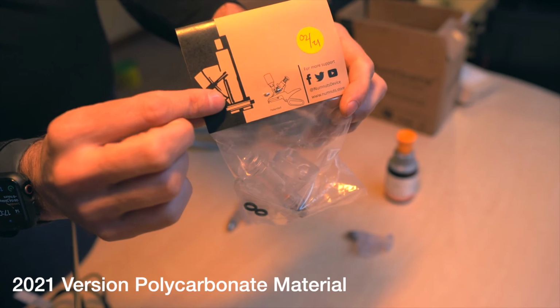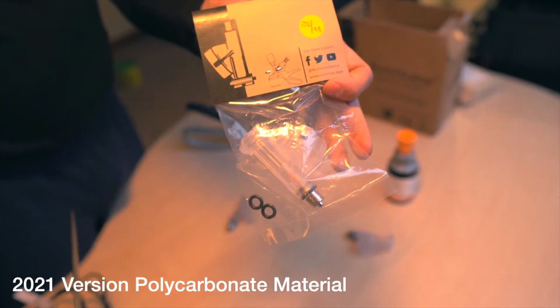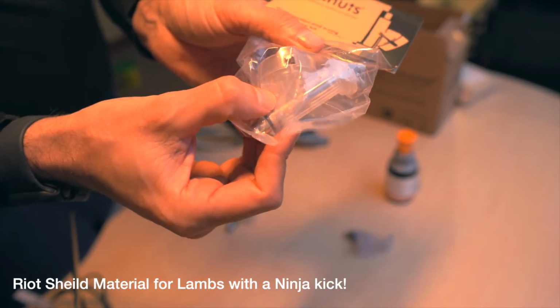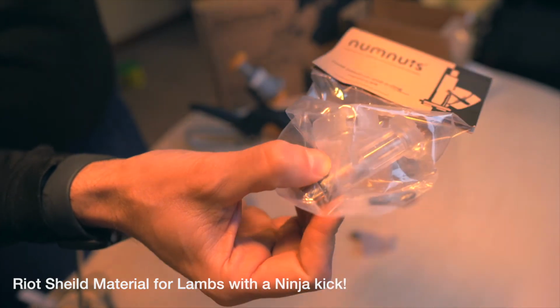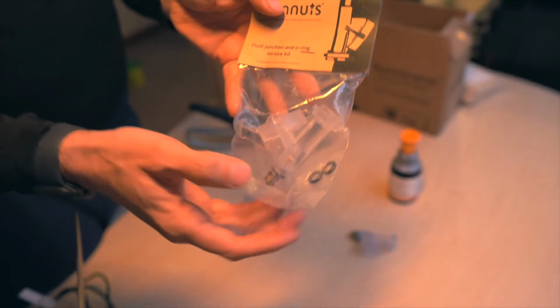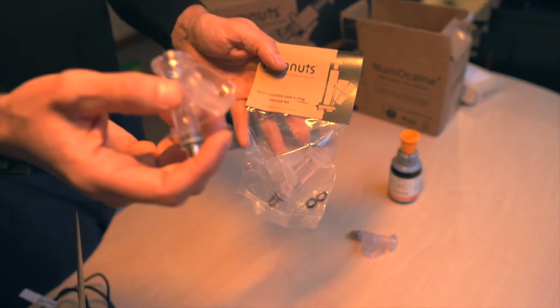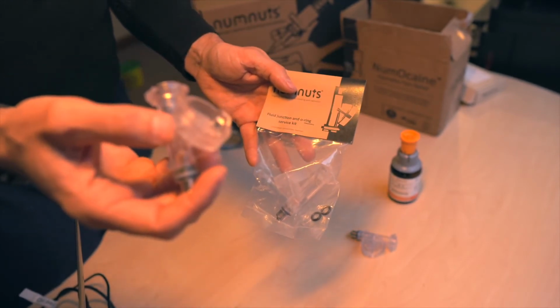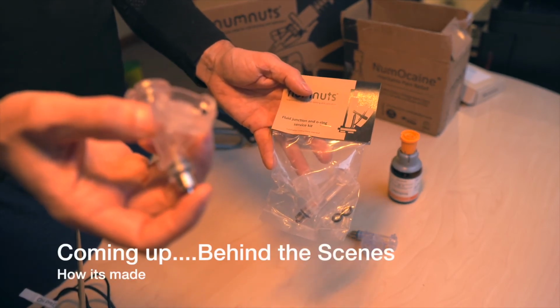You know that if you've bought your device in 2021 or have a fluid junction that has the date on it there, that you've got this newer polycarbonate, same material that they make riot shields out of. Every polycarbonate fluid junction sold in 2021 has a white Tipex dot. You'll just see it down in this corner where my thumb is there. And so far these have proven very reliable. And it's just an example of a component going through its standard life cycle improvement and refinement stages as we've received feedback from the field. So thank you for everyone that's told us about it, and that's the history of one little component called the fluid junction.